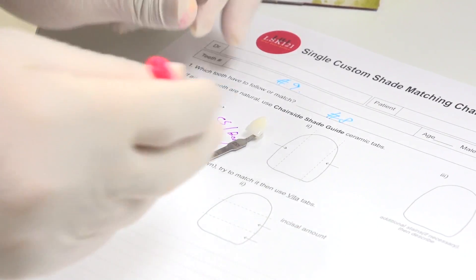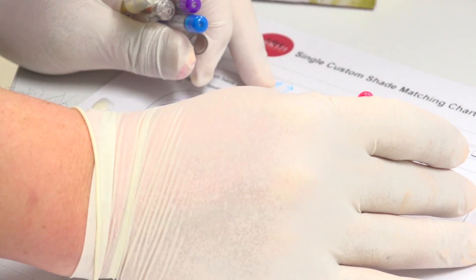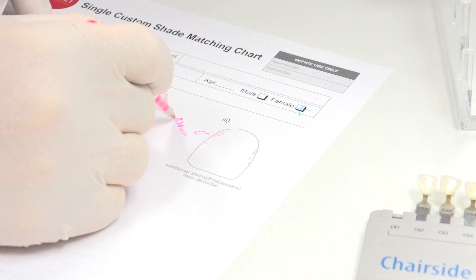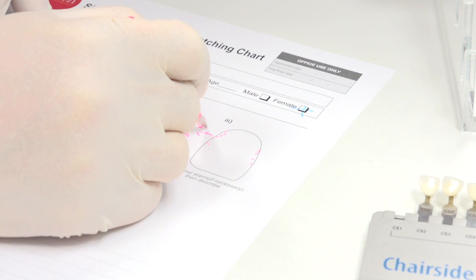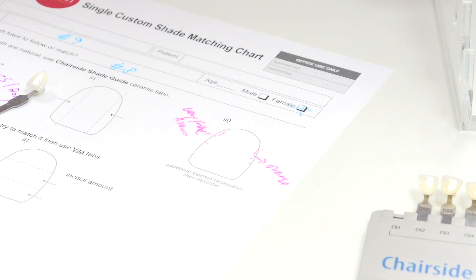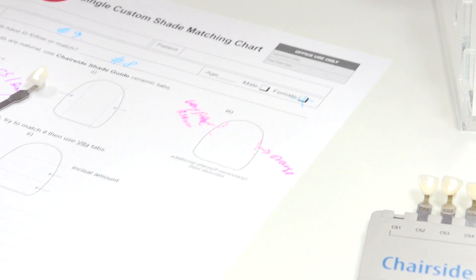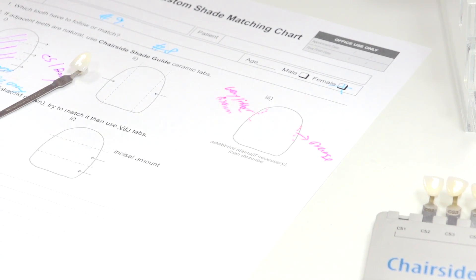I also noticed the patient has a very subtle, slight stain because they've worn the veneer for eight years. There's a very subtle brown color and a little orange color as well, which I indicate on the chart.